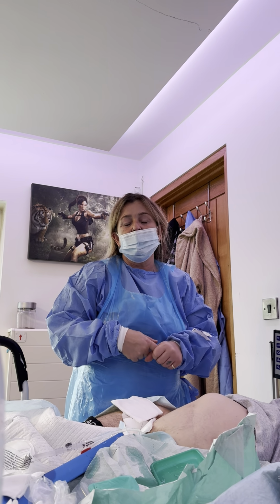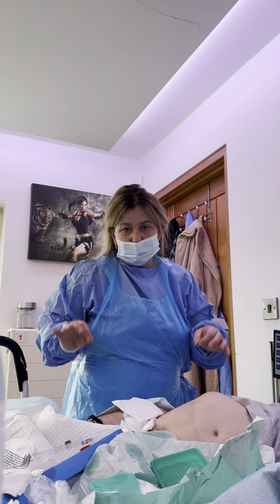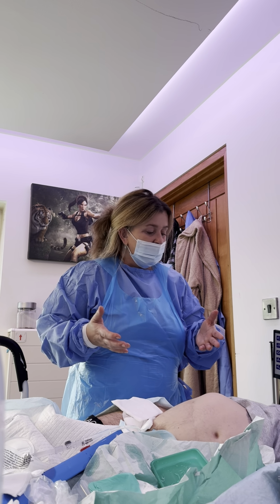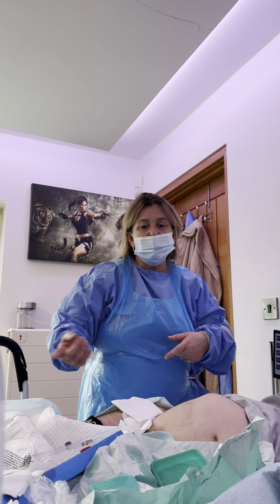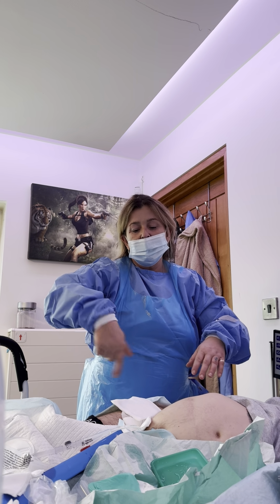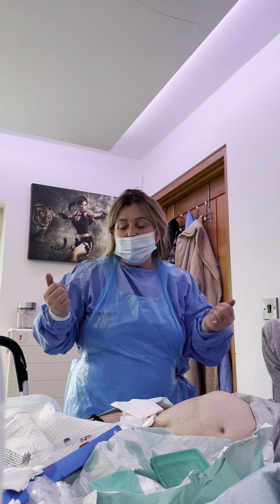So this is a general suprapubic catheter change. It's running smoothly. It's very perfect. Ben's breathing is fine because it normally affects his breathing. I've got no idea now, love. No idea. And then the rest of it, I'm going to double glove back on. I will clean the tube now. I will sterilise the tubes. I will clean them all up. I will clean the stoma, which I can't show you because I've got no one to help me. And that is what I'm going to do.